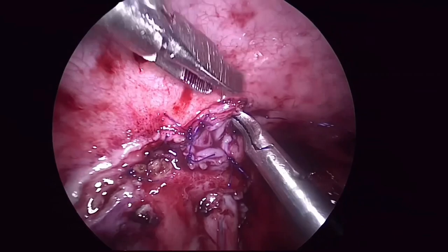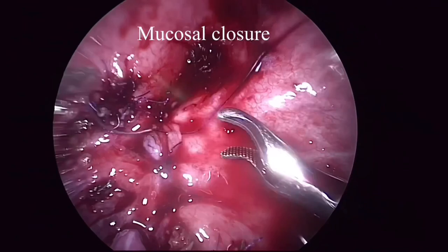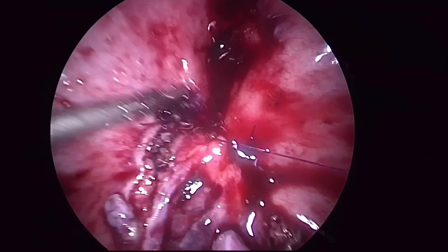After this, mucosal closure over the right hiatus is performed, and then mucosal closure over the left hiatus is also performed.